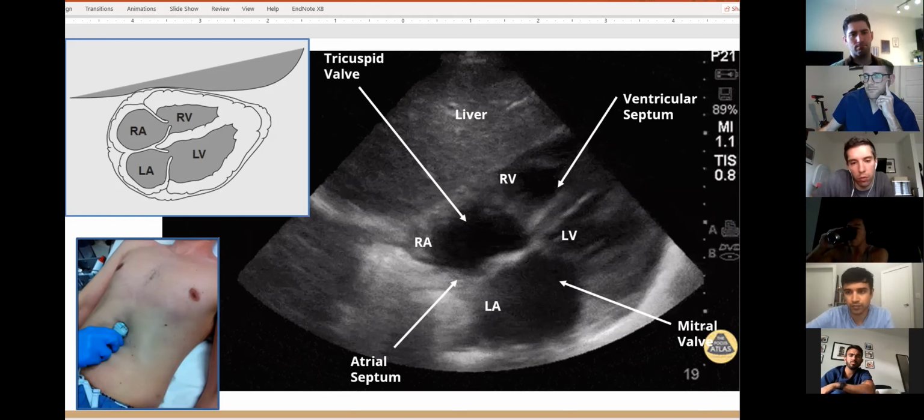It can also be useful for all of the stuff that we discussed before, particularly in patients where you're having a hard time getting either parasternal or apical views, like in patients that have really bad pulmonary disease, or in really skinny patients like Spencer was saying before, intubated patients too, because with positive pressure, it becomes very difficult to image sometimes. And obviously those patients, we can't turn on their side. So this can be your friend. Usually this is the easiest image to acquire, to be honest. Although sometimes it can be difficult, but usually this is a pretty easy one to get good pictures of.